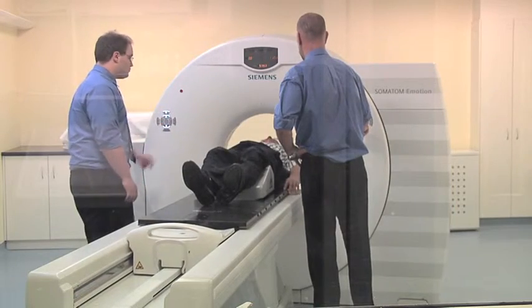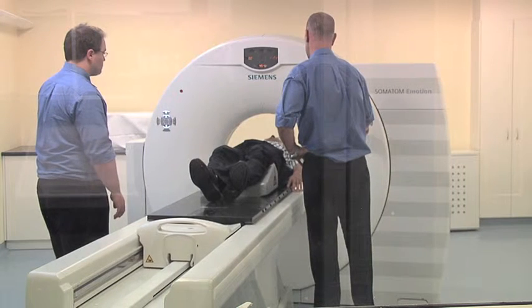Your daily treatment sessions will last approximately 15 minutes, and the time of these sessions will generally remain constant through the treatment schedule. The radiation therapist will provide your treatment each day and assess your progress. In addition, a nurse will see you on a regular basis, and your oncologist will generally meet you on a weekly basis. Your team is here to help you and requires your feedback to get the best results. If you have any concerns about your treatment, please notify your radiation therapist, who will organise for you to meet with your oncologist or the nurse as soon as possible.